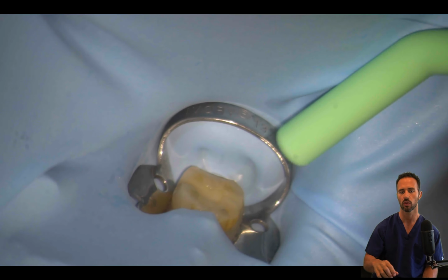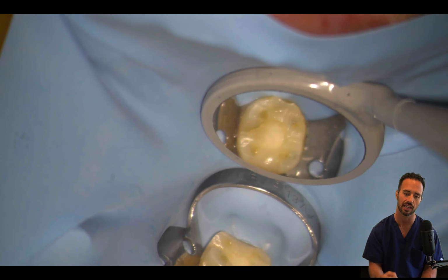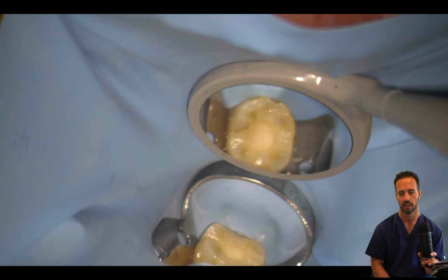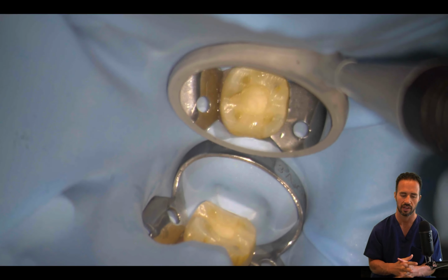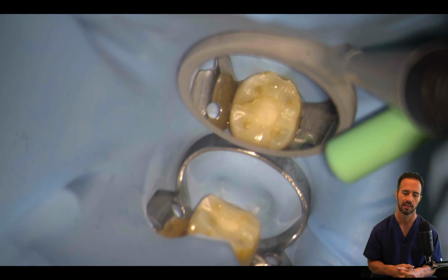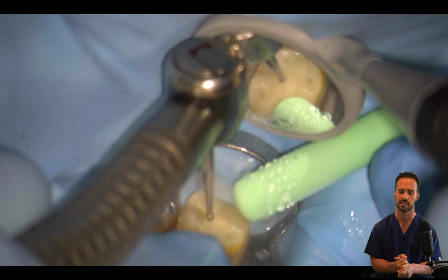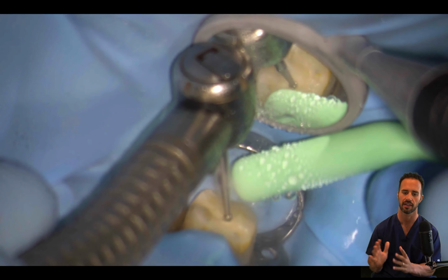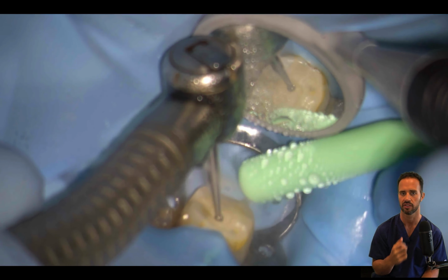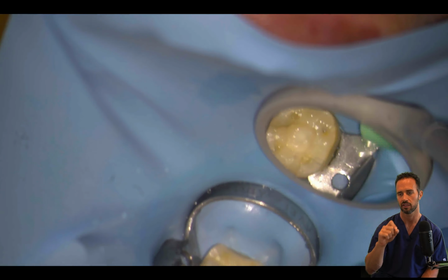And now we're simply going to be removing the temporary restoration, which in this case is our Fuji 9 glass ionomer. We're going to use a surgical length round bur, as we always do, size number 4. If you want to use a size number 6, you can as well. Size number 4 is what I use for the vast majority of my access preparations, unless we're dealing with anterior teeth.